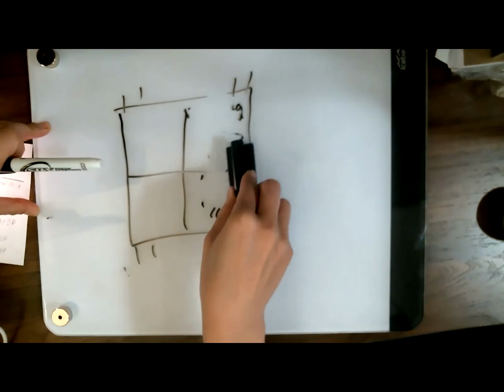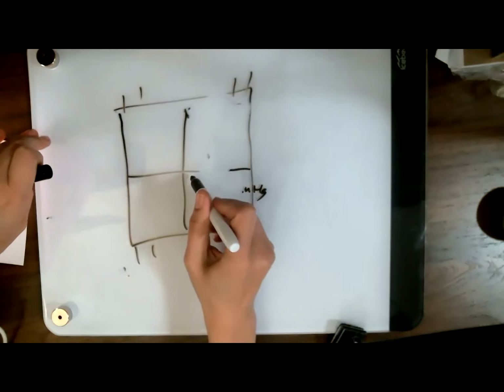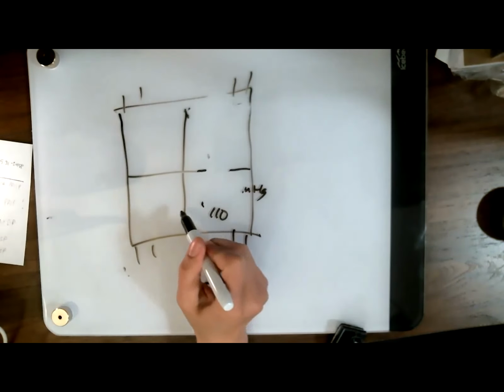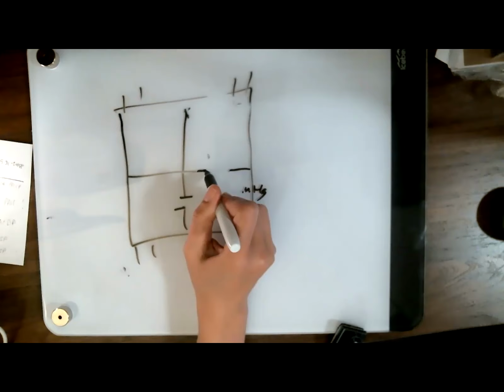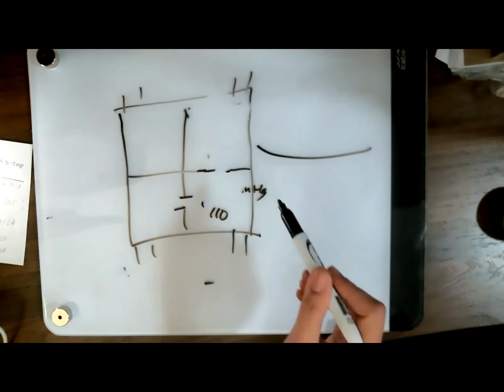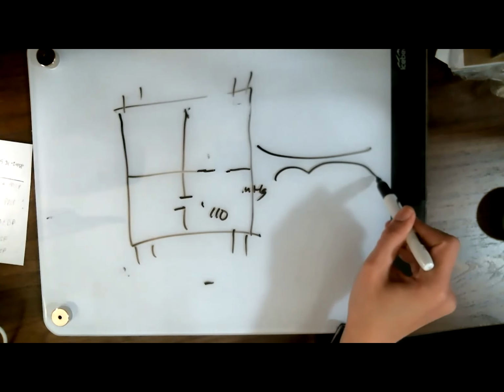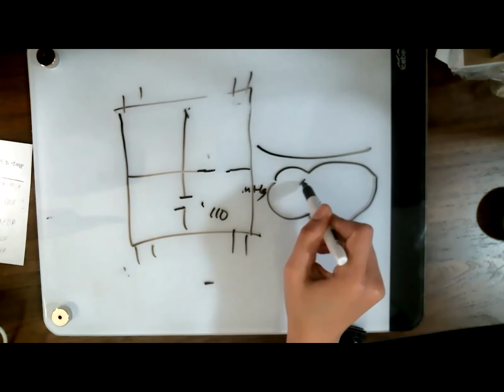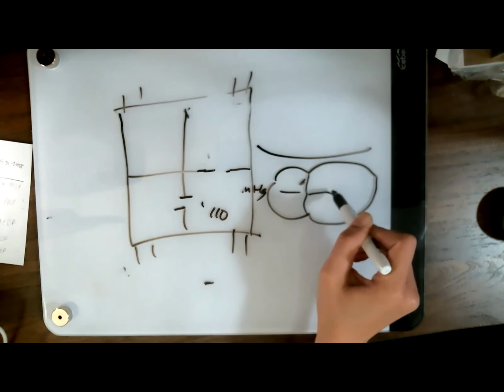And now we have a VSD. Primarily the flow in a VSD is systole or diastole? Systole. Great. So we're in systole. Let's take an example. We're in the subcostal view. So here's your liver, here's your heart. And then here is your nice VSD.